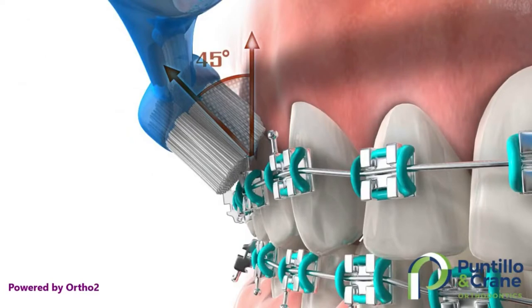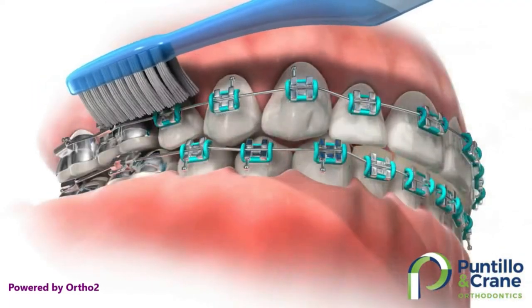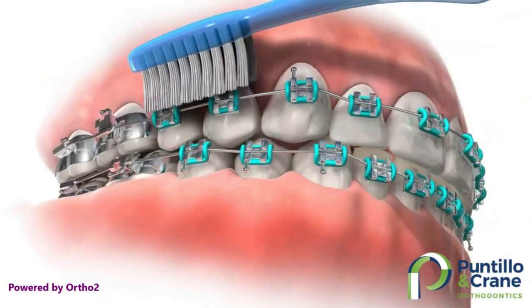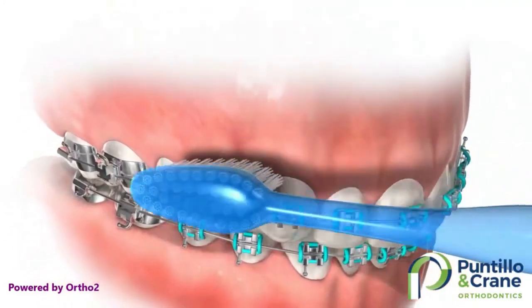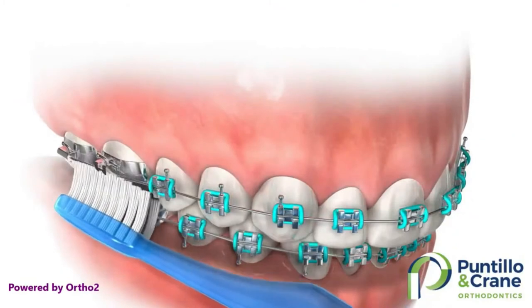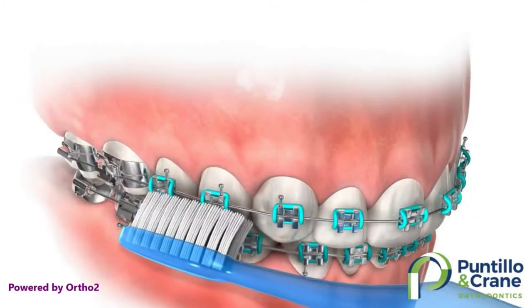Turn your toothbrush in three different positions, reaching the top of the braces, the bottom of the braces, and the front of the braces, spending at least 30 seconds in each position. Make sure to look in the mirror after brushing to see that all areas are clean. Don't forget to brush your chewing surfaces and the back of your teeth.